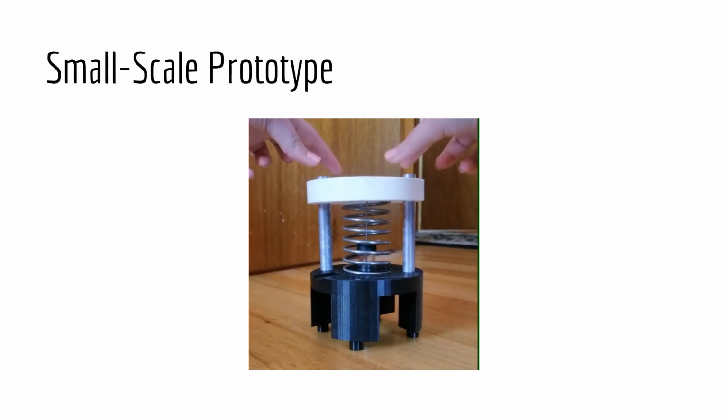As seen in the video, when the prototype is compressed, only the spring reacts. This is because the pull damper allows for air to easily flow out of the valve. In decompression, however, the spring is pushing up on the contact plate while the pull damper only allows a specific amount of air in, dissipating the energy of the system and creating the desired hysteresis.